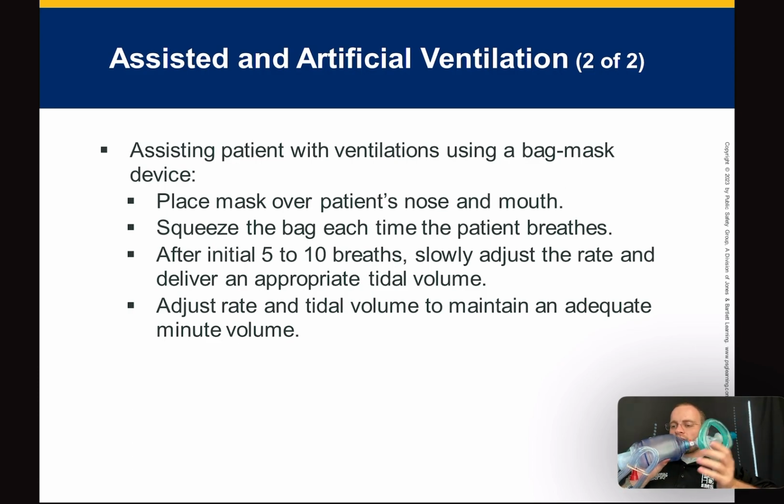Now this is a one-handed tool. If I see you hold this with two hands, you're going to disappoint me. It's a one-handed tool. You can cause harm, and we do not cause harm, but you can cause harm if you use two hands. This bag, this one's probably well over a liter. It's 2 liters. This says right here it's 2 liters. And how much air did I tell you tidal volume was? Right, it's 500. So you only need like a quarter of this to go in their lungs. It's a one-handed tool. If you firefighter this, as I like to call it, and just squeeze it all, it's unnecessary. You're causing harm. So it's just a one-handed tool. We'll squeeze of the bag.